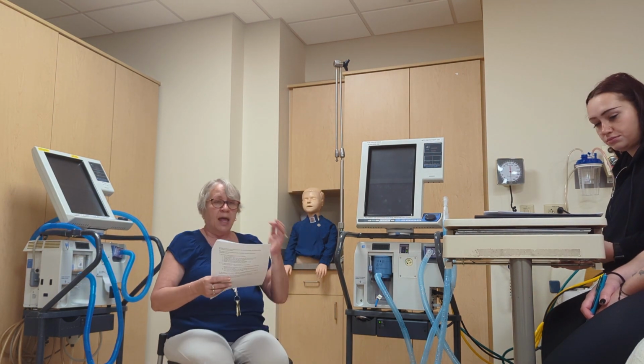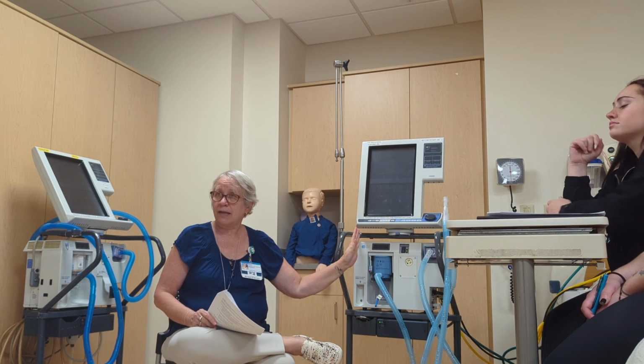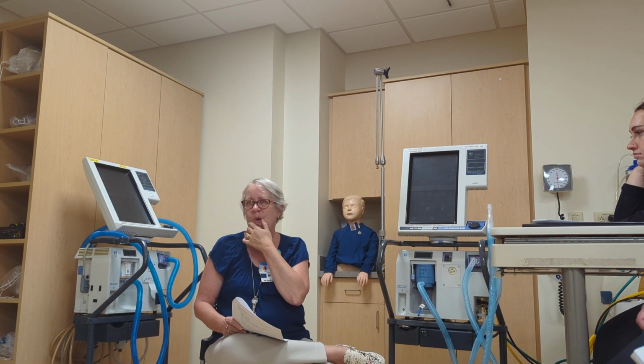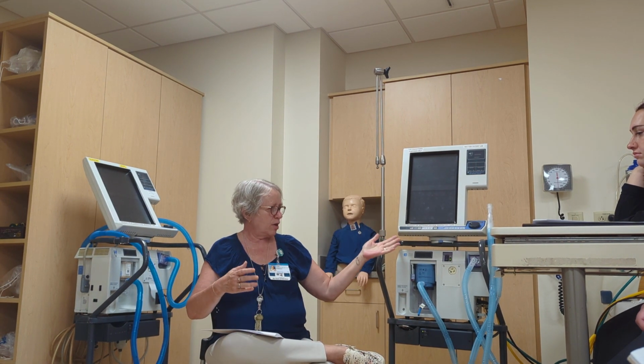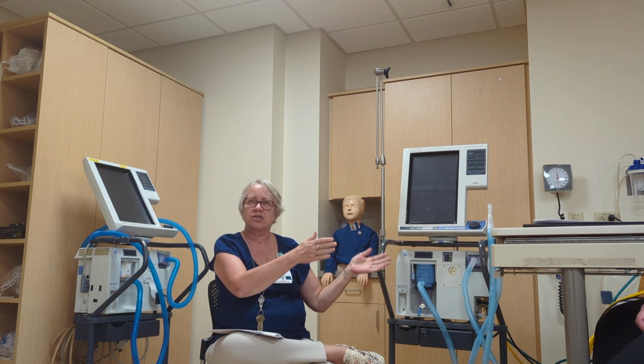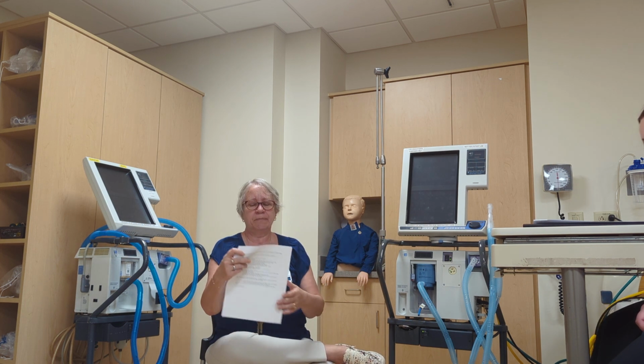You don't have to do it clinically because you run that SST and it does your tubing compliance for you, right? So tubing compliance is how much volume am I losing to the stretchiness of this tubing? That is what we're looking for, okay?